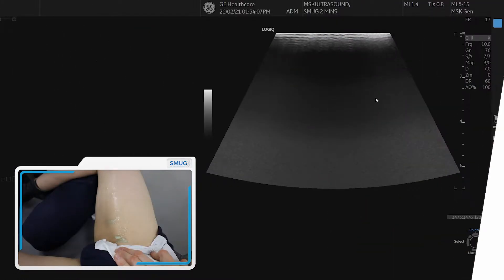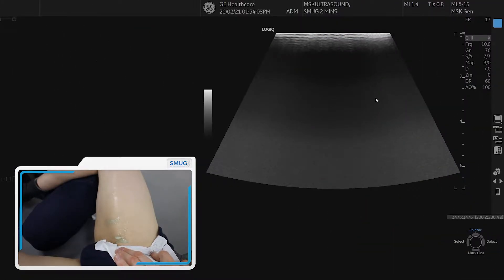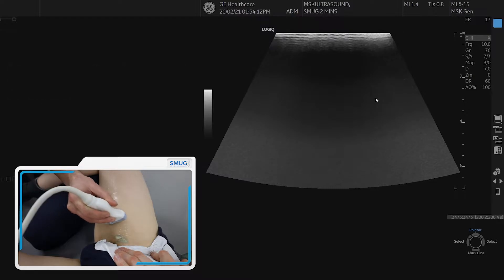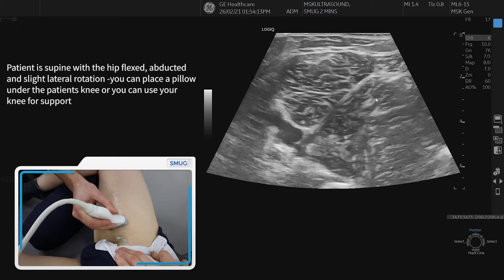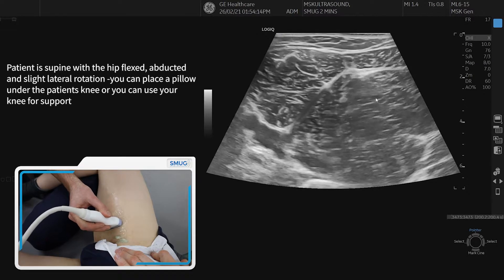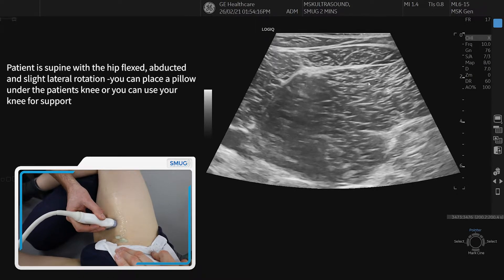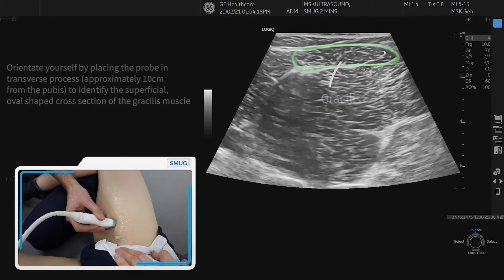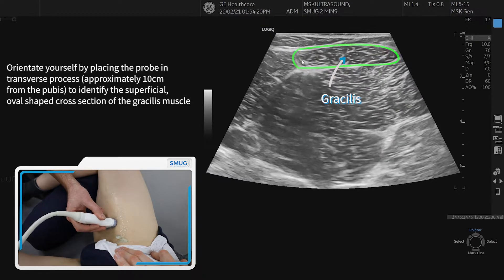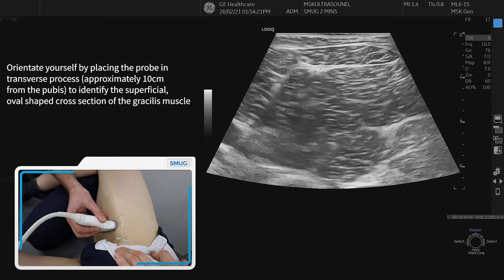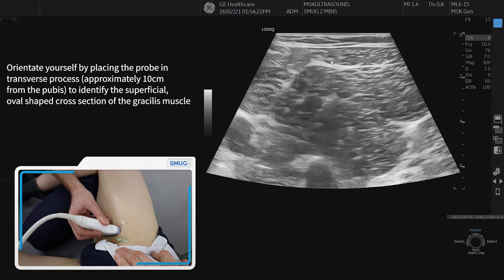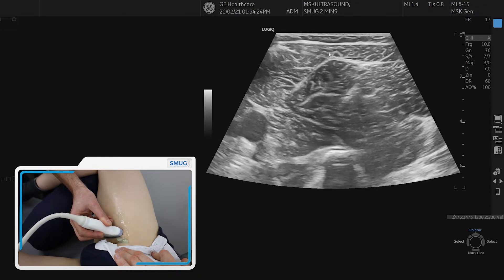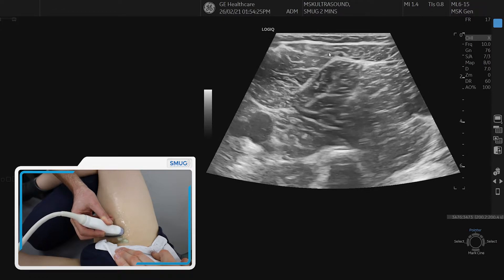To assess the adductor region on ultrasound, first we get the patient to go into a Faber's position. We then orientate ourselves on the anatomy by finding gracilis, which is at the most superficial aspect of the screen. As we go towards the pubis, we can see the three columns of the adductors.